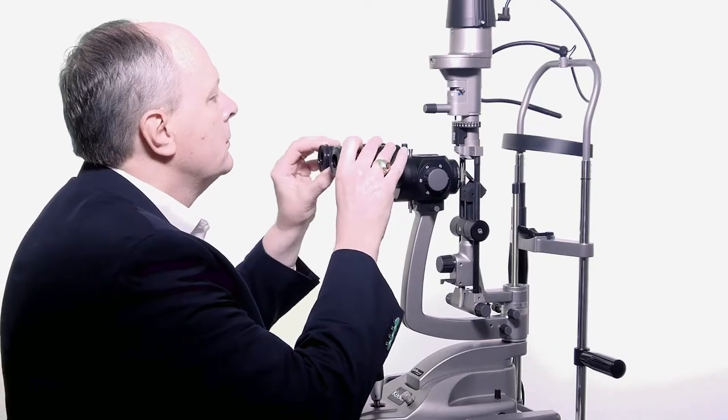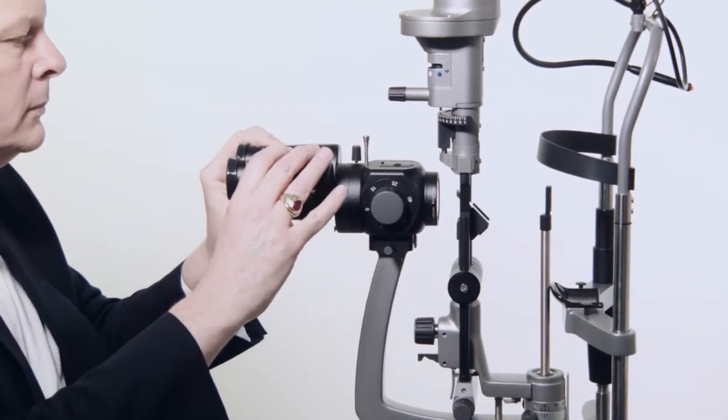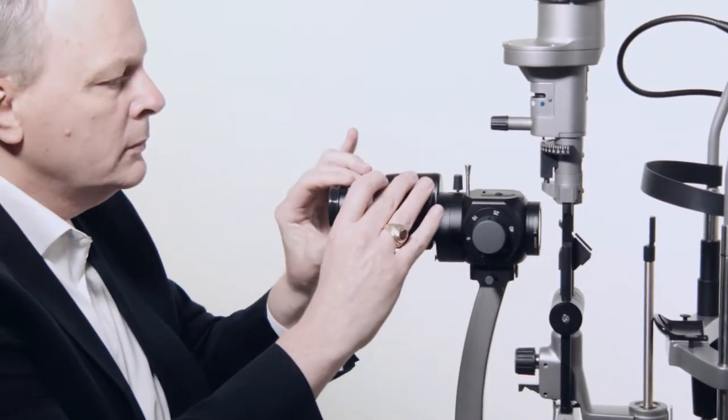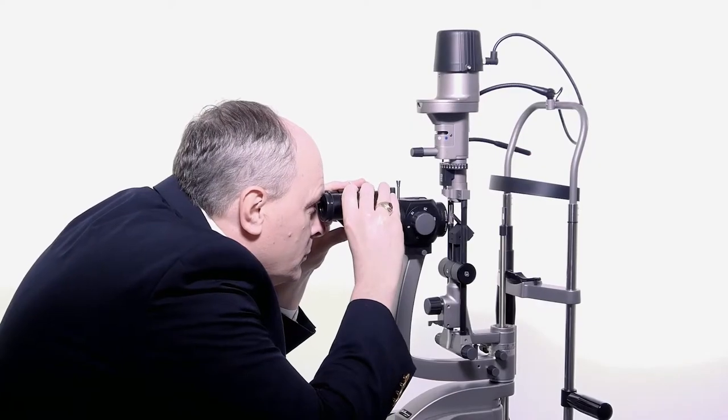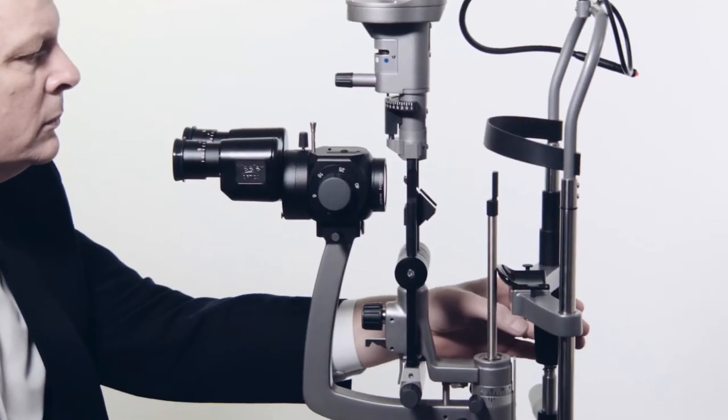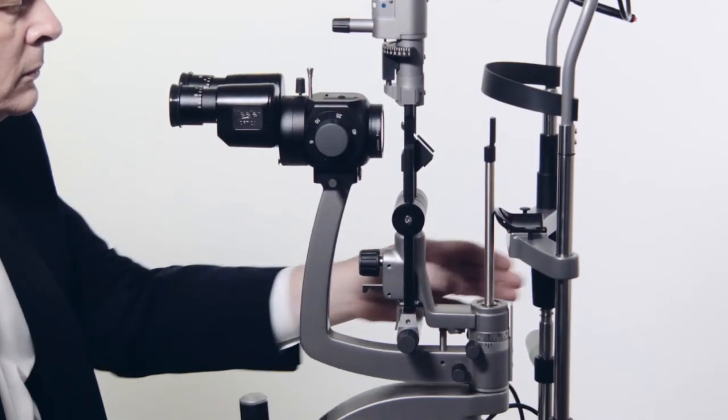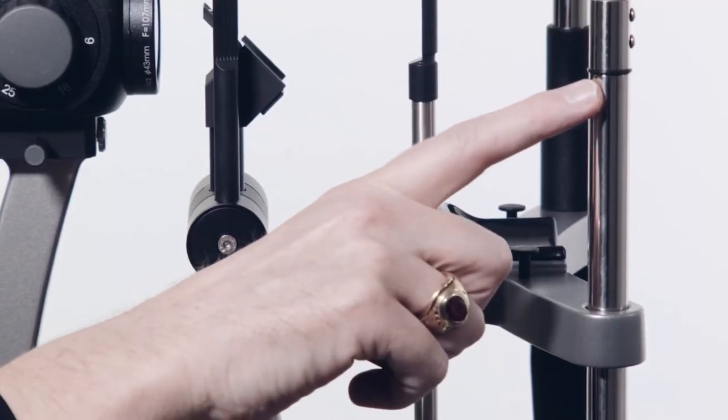Before using the slit lamp for examination, adjust the eyepiece's pupillary distance or PD. The PD ranges from 49mm to 77mm. Adjust the chin rest height so that the patient's eyes are level with the height mark on the chin rest support.